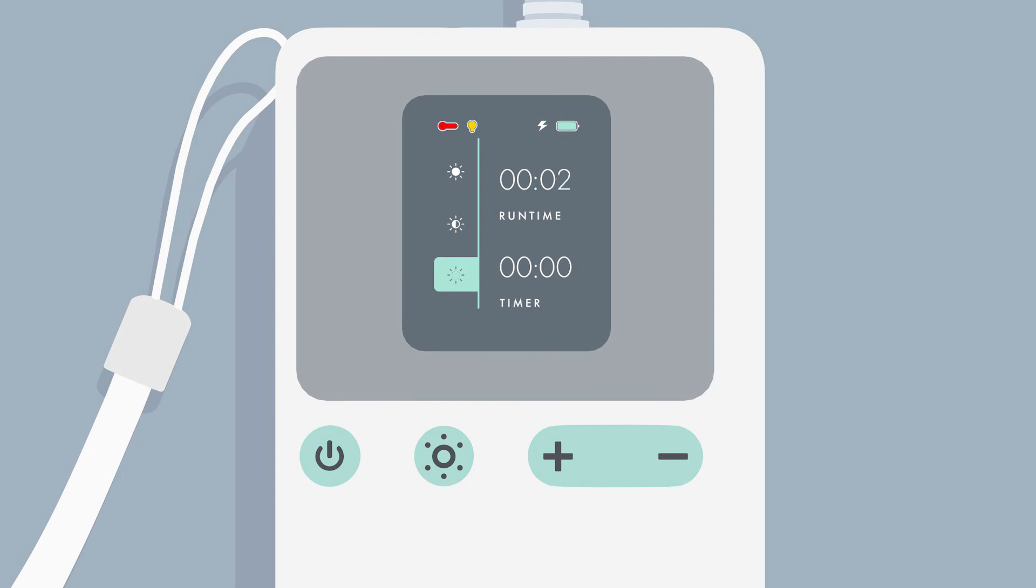Operating Time shows the total elapsed time the light pad was on for the current session. Remaining Time displays the remaining time on the timer mode.